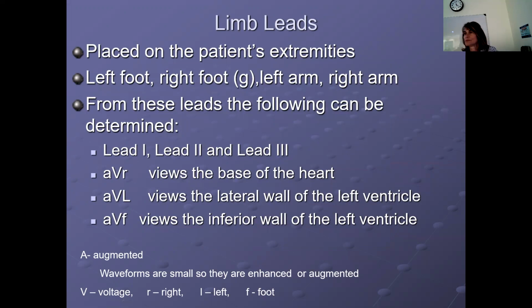Because I did an EKG and they put the left leg and the right leg on the top, and then they put the 6 leads below. So what's the difference? Reading in the textbook, it does mention that the view is going to be different depending on how far away the lead is. Did it say how it's supposed to look different?